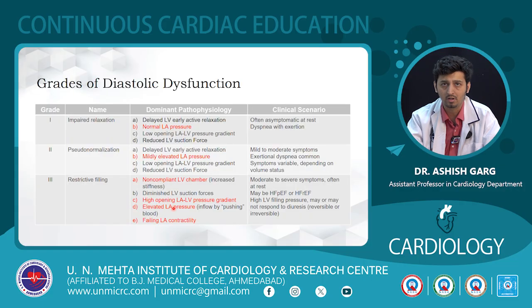So coming to the grading of diastolic dysfunction, there is 1, 2 and 3 grades. One is impaired relaxation. These patients have delayed LV early relaxation but a normal LA pressure, and are usually asymptomatic at rest, may have dyspnea with exertion.